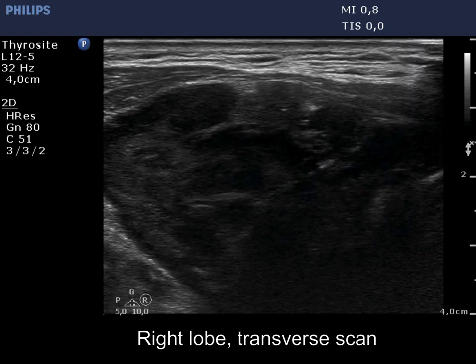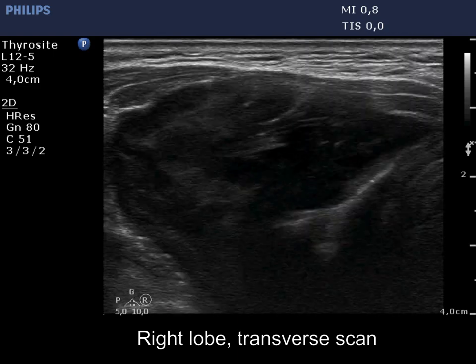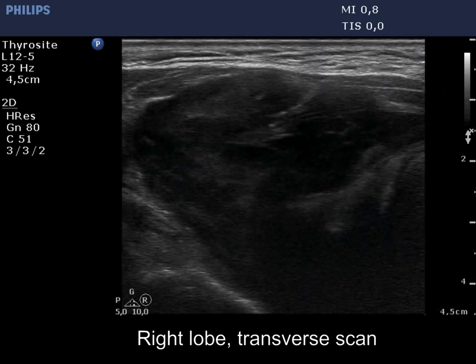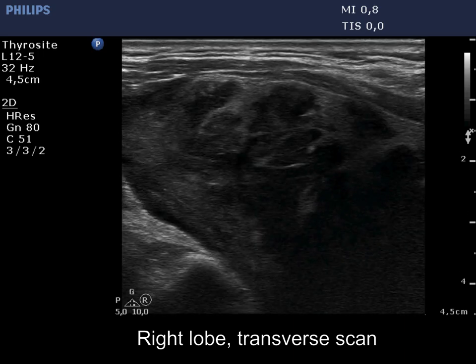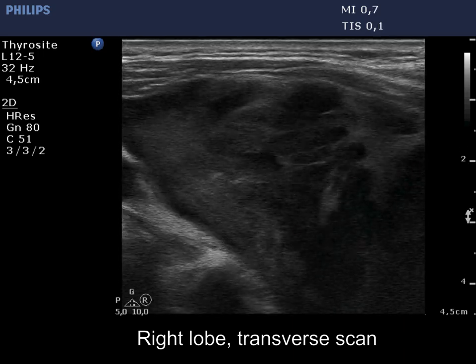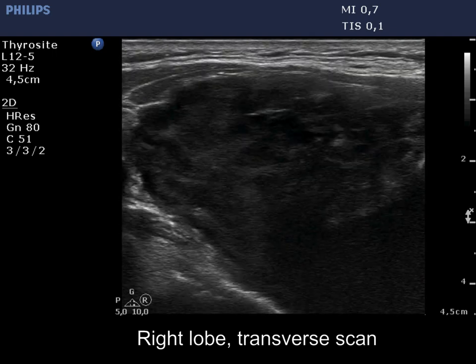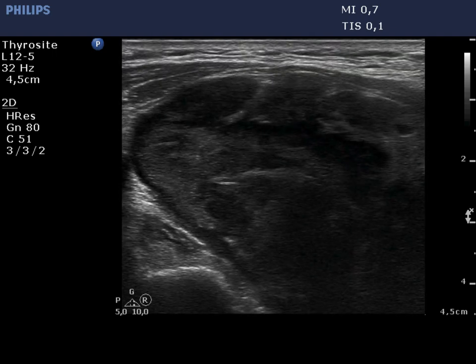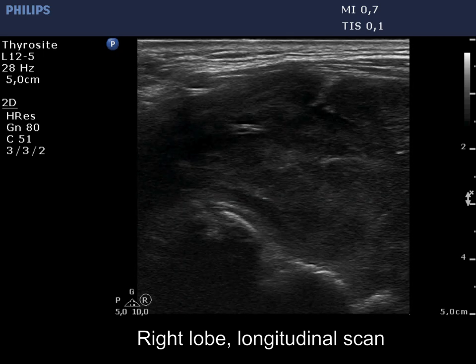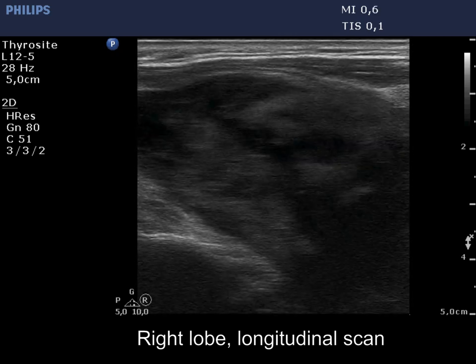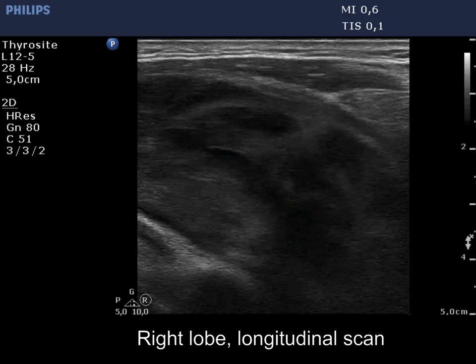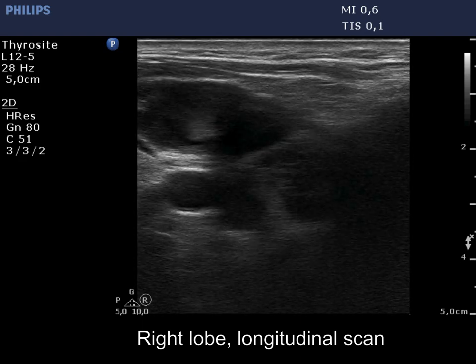The right lobe is extremely enlarged. The lobe is echotextural abnormal and has numerous discrete hypoechoic lesions. These differ in the degree of hypoechogenicity and in size. The pattern is very close to the focal form of Hashimoto's thyroiditis. These lesions have irregular shape. Note the presence of echogenic lines dorsal to the hypoechoic fields.